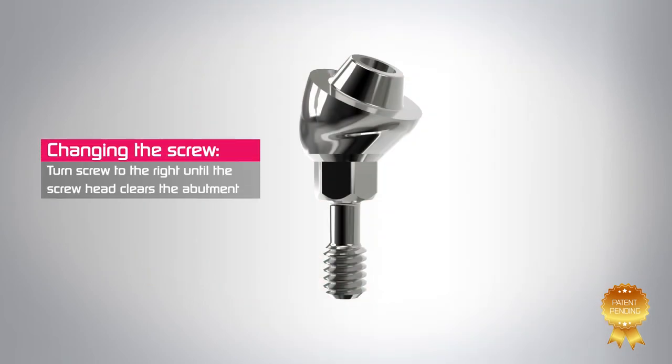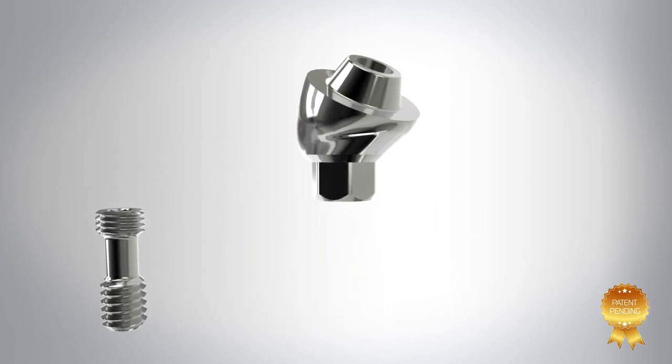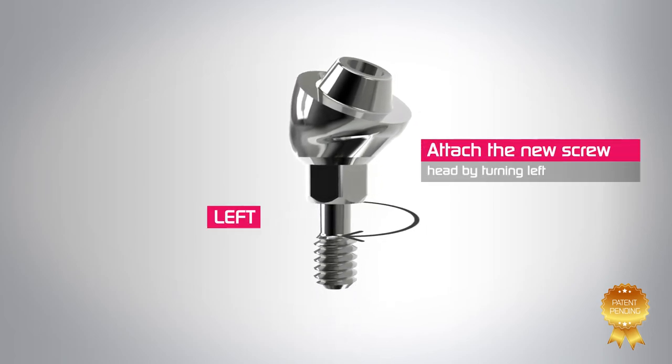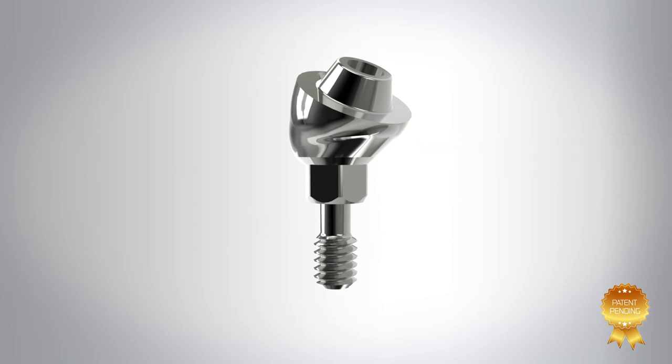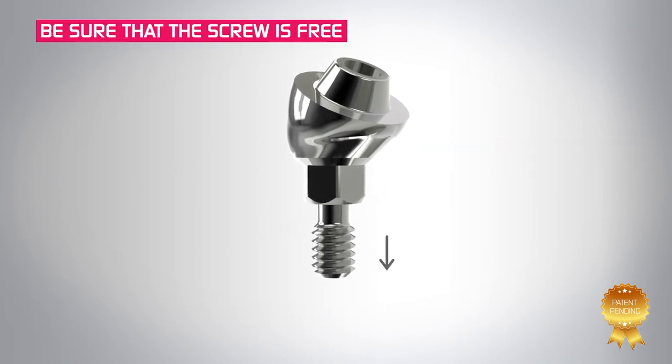Detachment of the abutment screw from the abutment is done by turning the screw to the right until the screw head clears the abutment hex and the screw is free. The new screw is attached by screwing the screw head into the abutment hex turning left, making sure that the screw is freely moving up and down within the abutment.